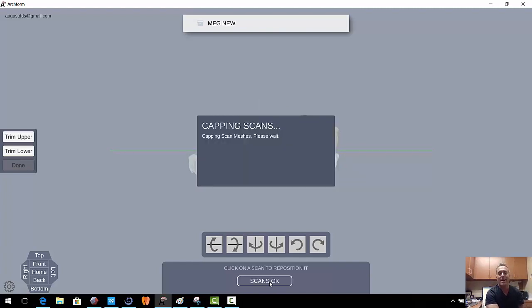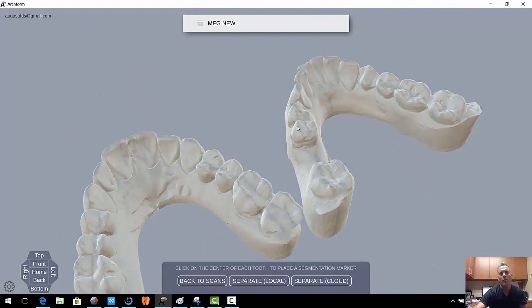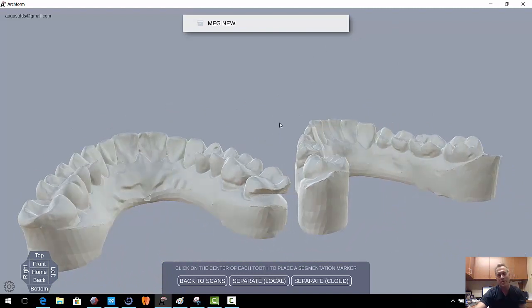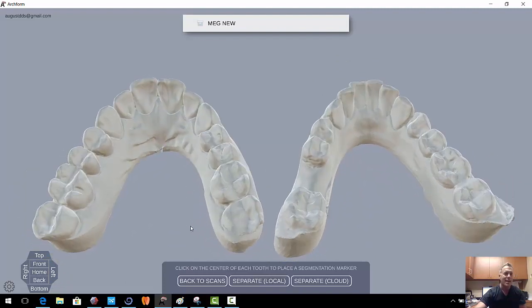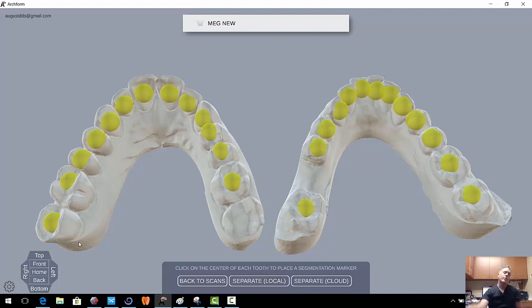Cool thing about the software, it automatically puts a base on your model, which I think is a really nice feature. All we're going to do now is mark which teeth are to be included. I think you can see that we've got a little problem with tooth number 2 or 14 there, or 15 there. So I'm not going to include that one in my scan, but we'll go ahead and include everything else. So I'll click on this tooth. You just click on the teeth that you're interested in including in the aligner. If we don't like a tooth, we can unclick it. So I said I didn't want that one. Go ahead and click the lingual of those anterior teeth. Now, it's going to go ahead and separate it.